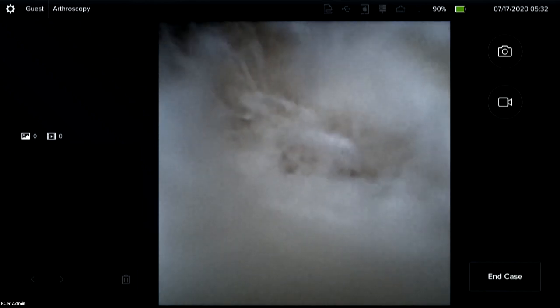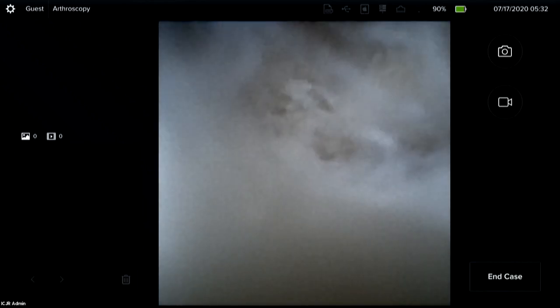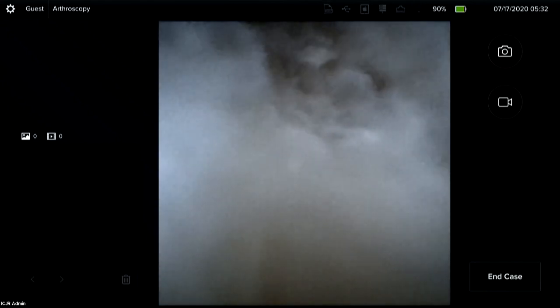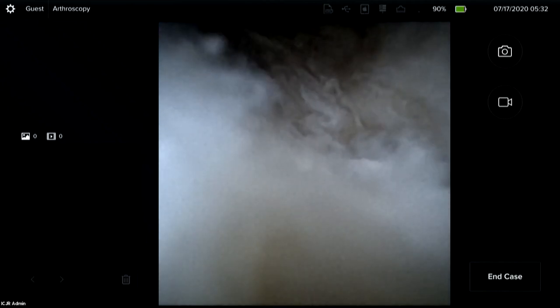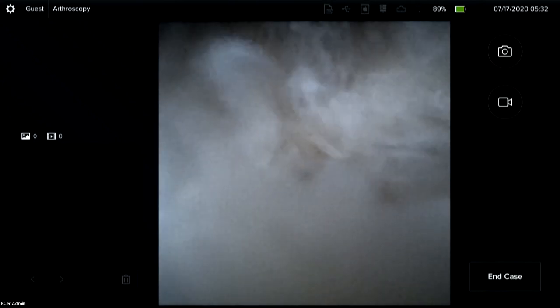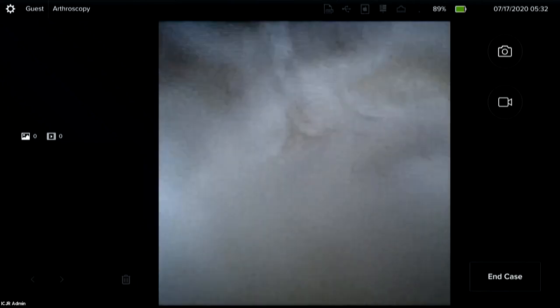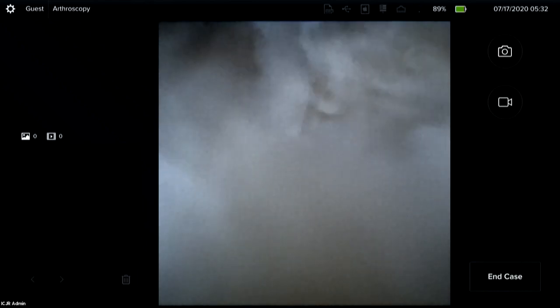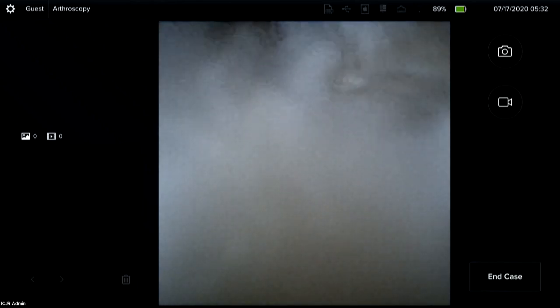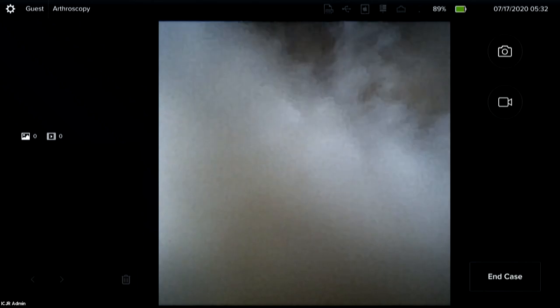We've also created a second incision along the ulnar aspect of the forearm and have already reamed. This isn't a true foveal TFC tear, so the TFC is not completely disconnected from the ulna, and mobility under the TFC is a little limited. In a truly injured wrist, you would probably be able to see the instrument coming up through the fovea, but I'm underneath the TFC here.